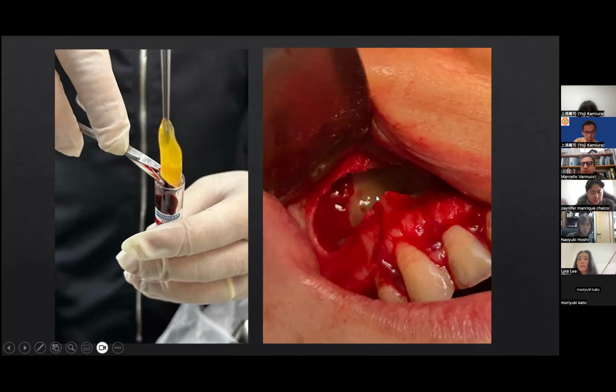After removing all the lesion, we first put the membranes over the lesion on the upper side, on the lateral wall in the palatine region, and the idea is to preserve all this osseous region, to avoid having two portions of, let's say, wound healing.